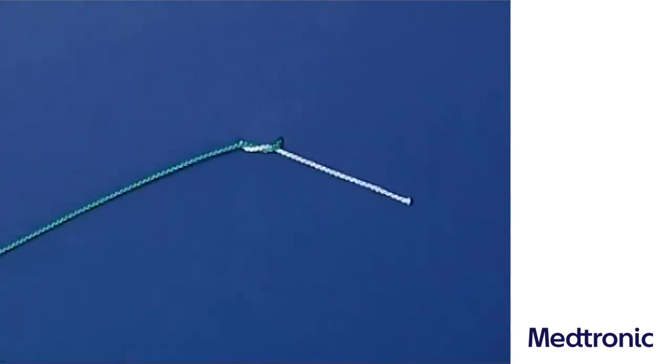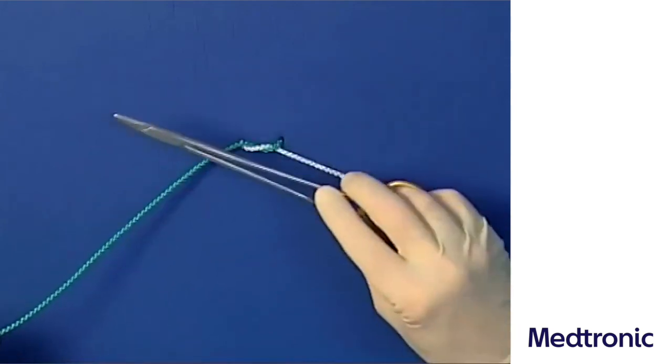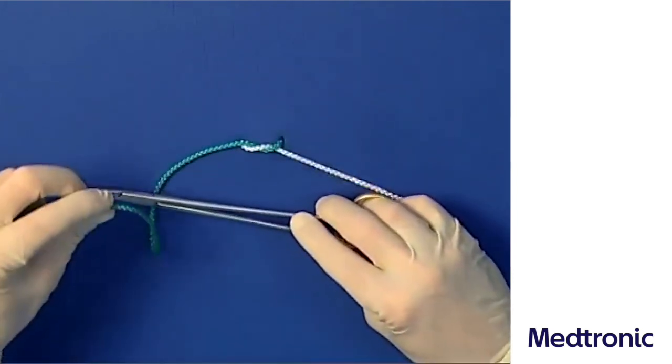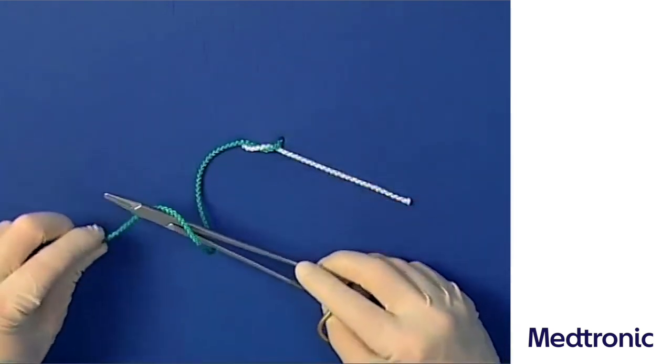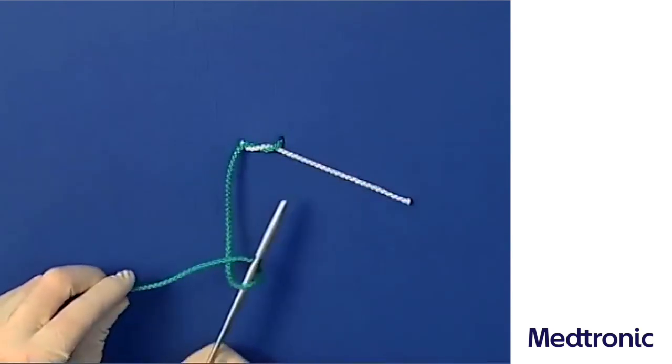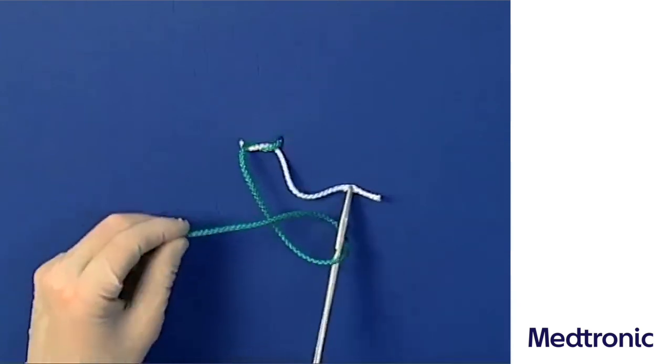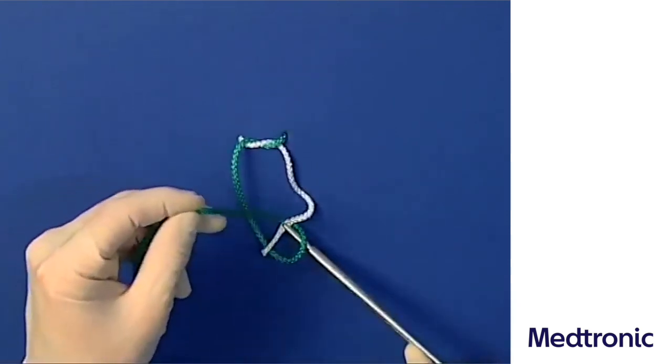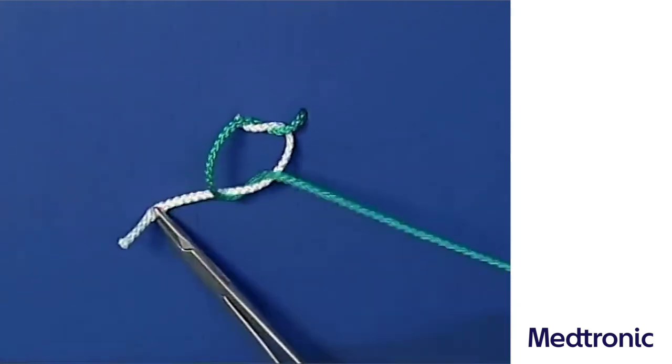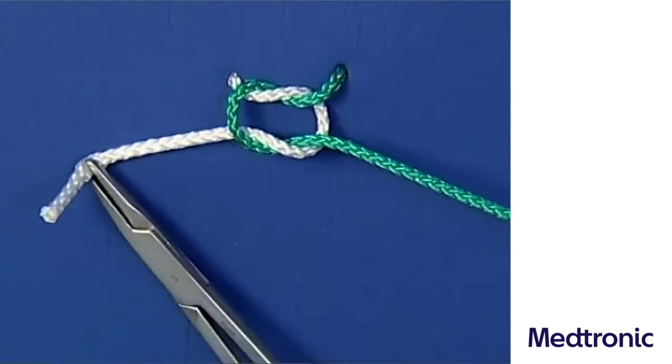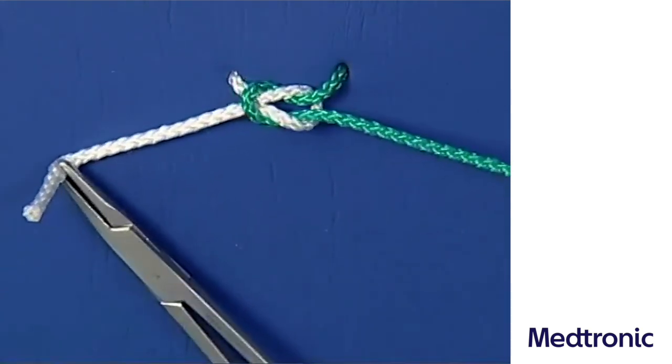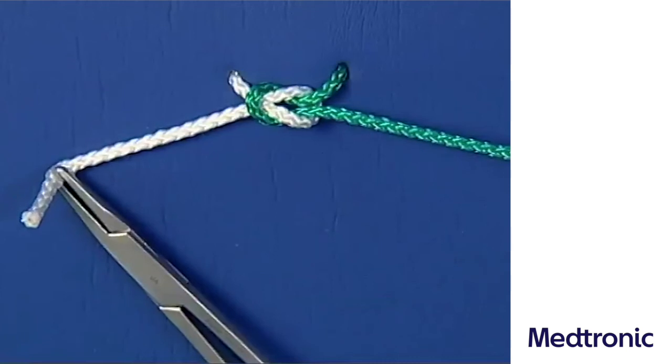The second opposed loop is now formed by leading the long suture end around the needle holder in the opposite direction. The short suture end is again grasped with the needle holder and led to the left. The long suture end is led to the right and then pulled. This is how to tie the square knot instrumentally.